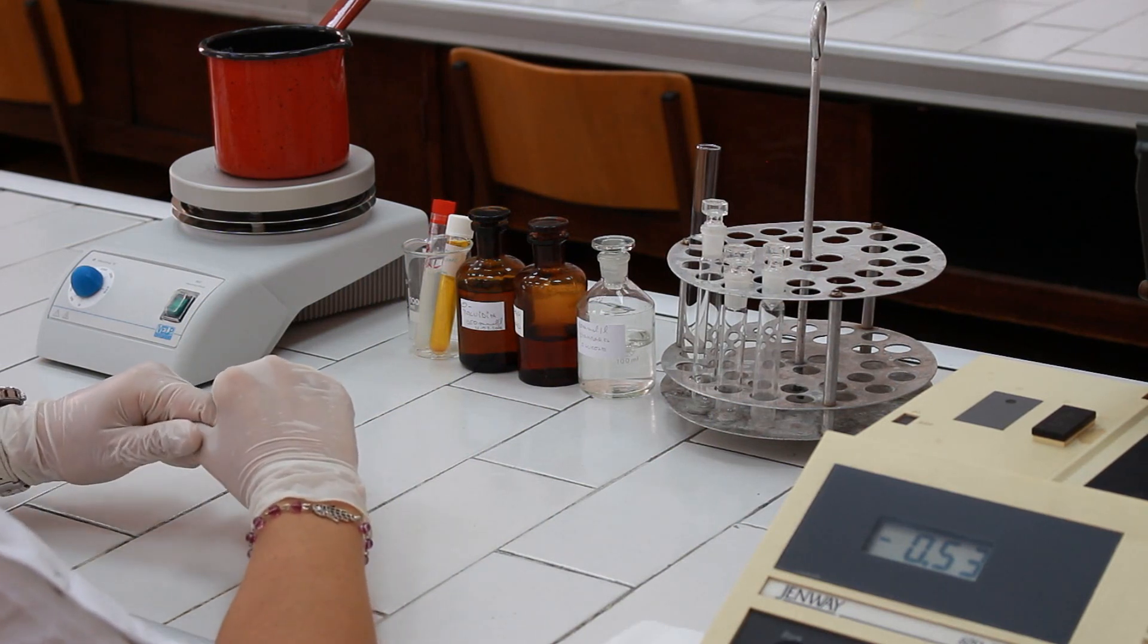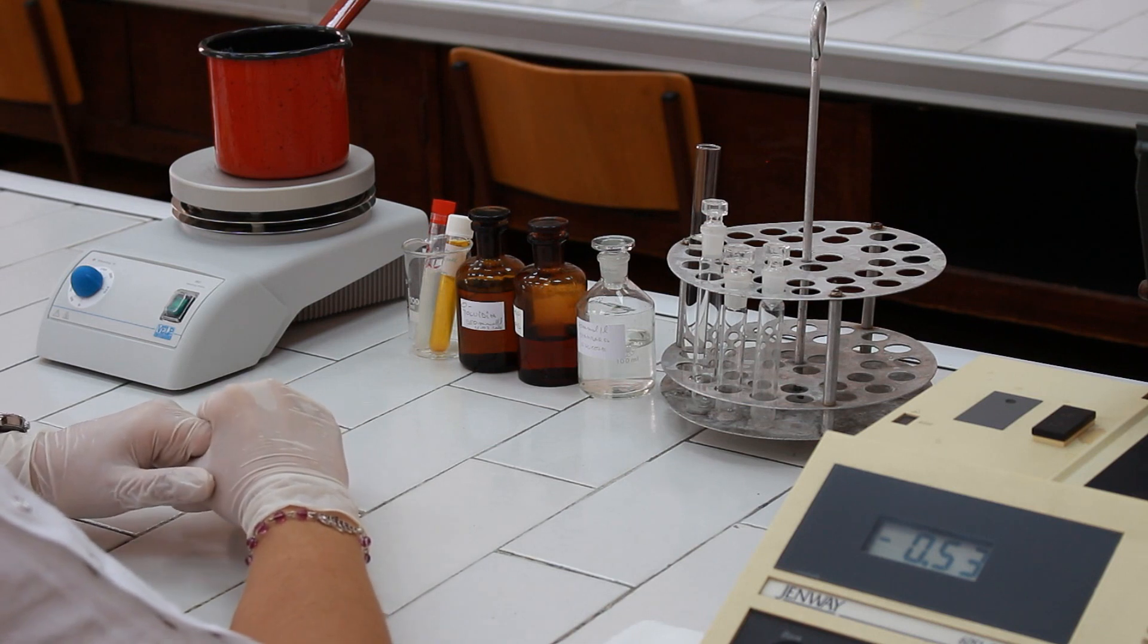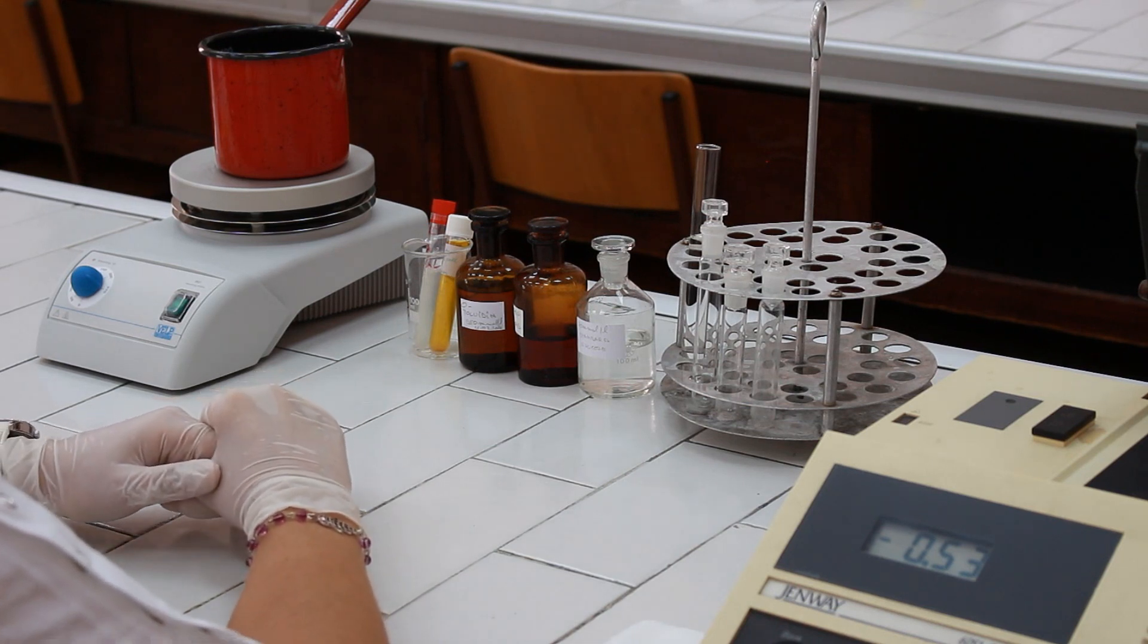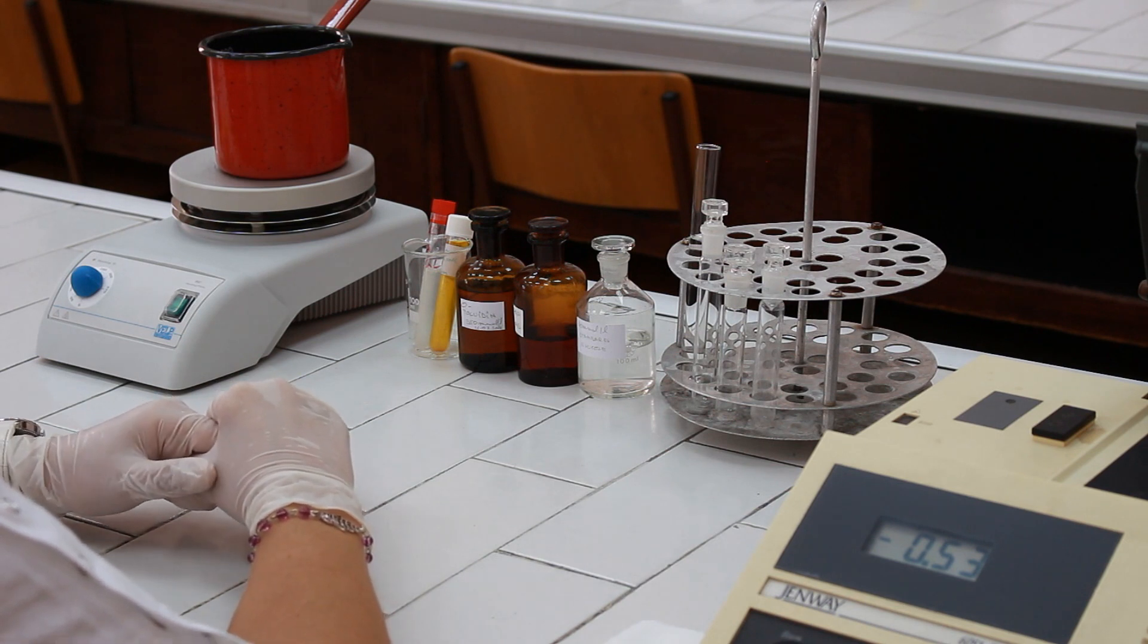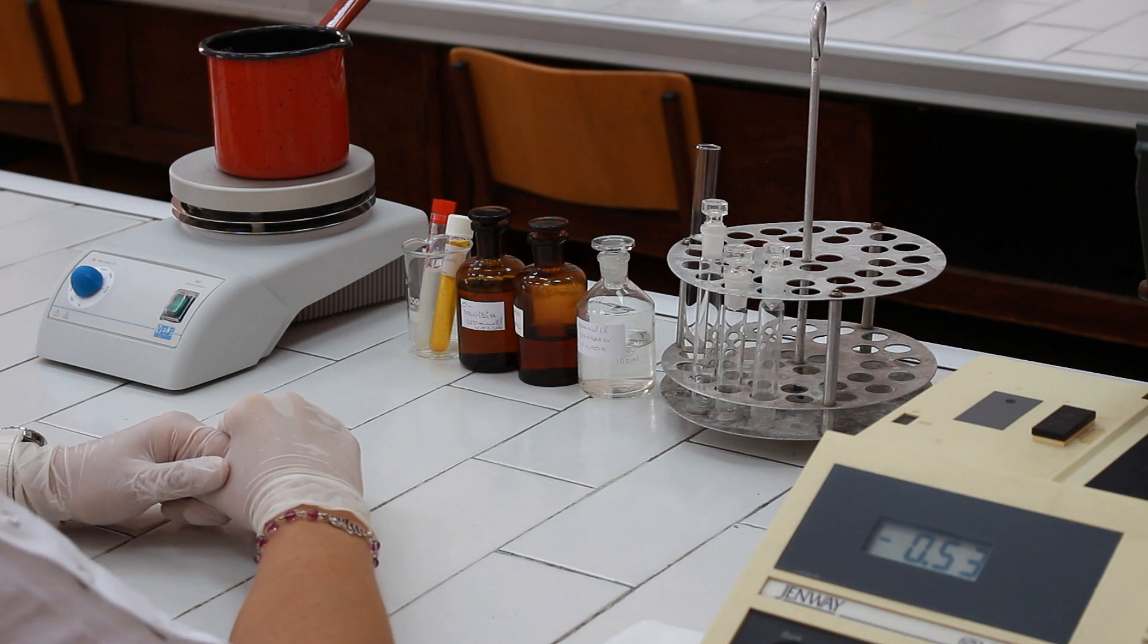Determination of blood glucose levels by orthotoloidin method. Orthotoloidin method is a chemical method for determination of blood glucose levels, which is based on the reaction of glucose with orthotoloidin or some other aromatic amines.